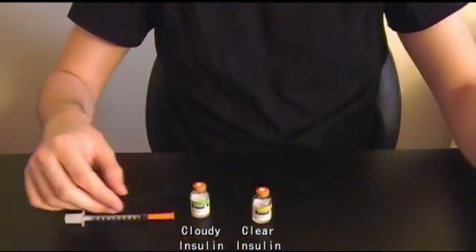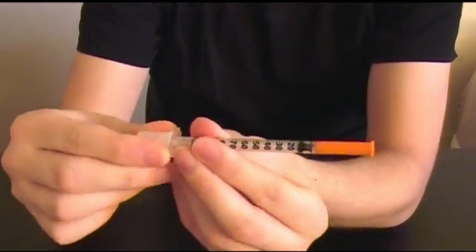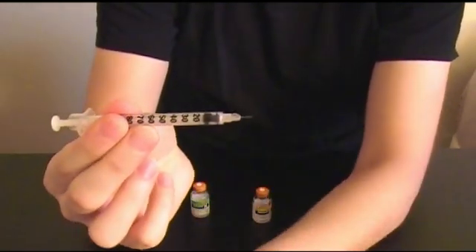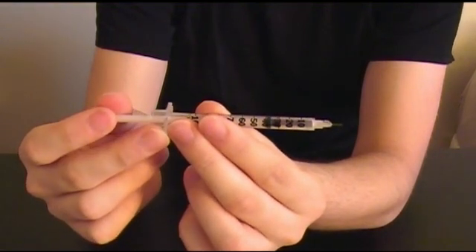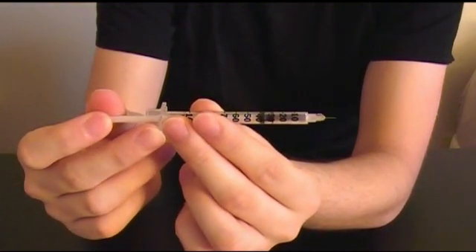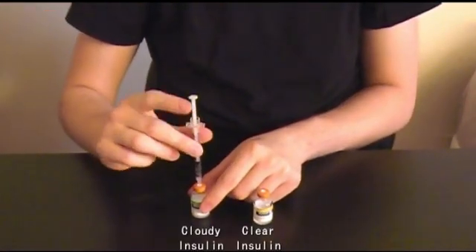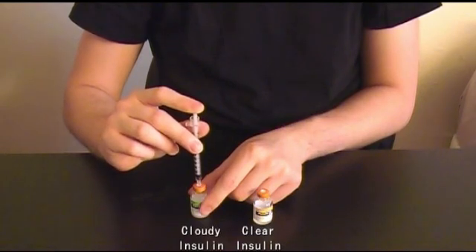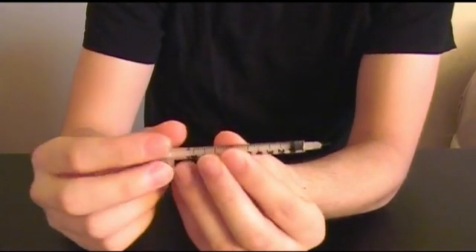First, you will add air into each insulin vial — do the cloudy insulin first. Remove the caps on your syringe and pull back the syringe so it contains a small amount of air. Insert the needle at 90 degrees into the cloudy insulin vial and push the air you withdrew into the vial. We do this to keep the pressure equal in the vial so your insulin is easier to draw up. Then remove your needle from the vial.